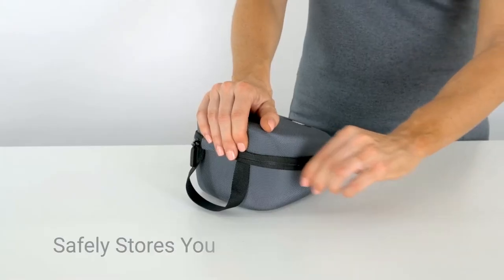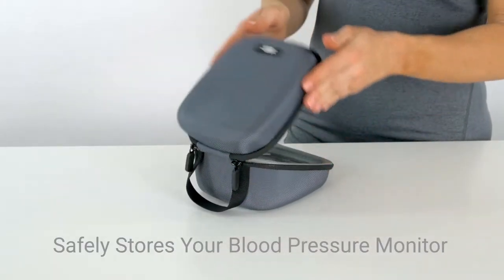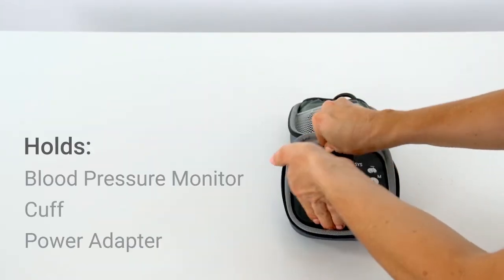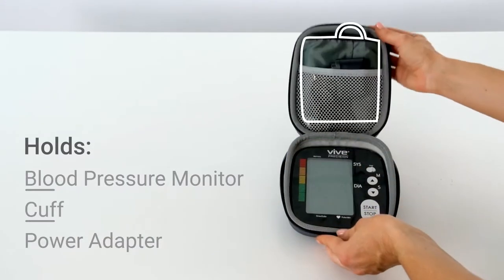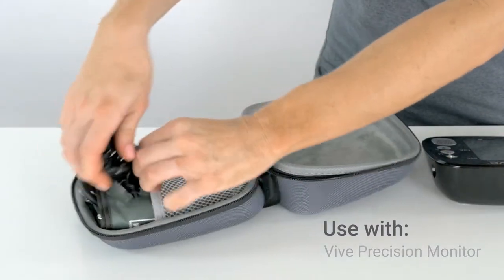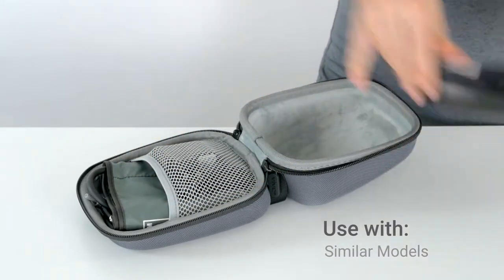The blood pressure monitor carrying case by Vive Precision safely stores your portable blood pressure monitor. The hard EVA case conveniently holds a blood pressure monitor, cuff, and power adapter. Used with the Vive Precision blood pressure monitor, Omron 5 blood pressure monitor, and similar models.